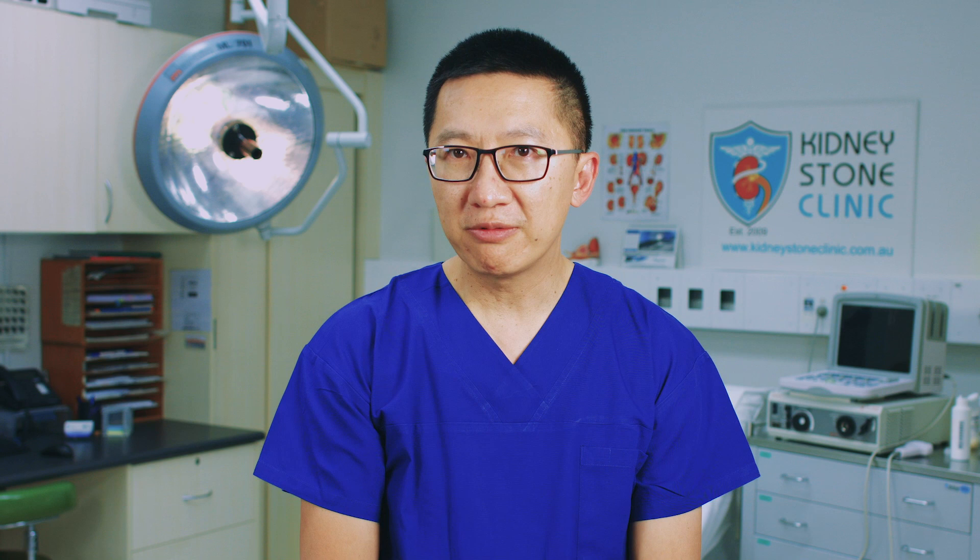Any bleeding points within the prostate cavity are controlled. The tissue that has been separated is cut up and removed for examination under a microscope.